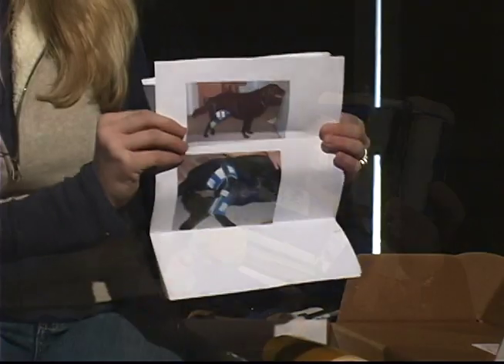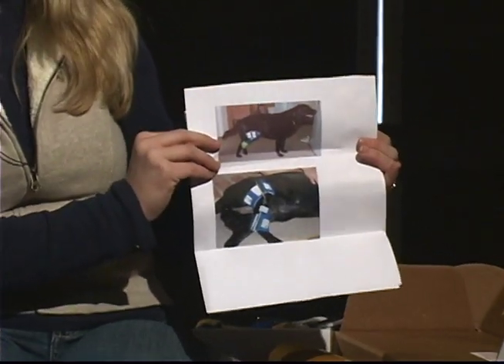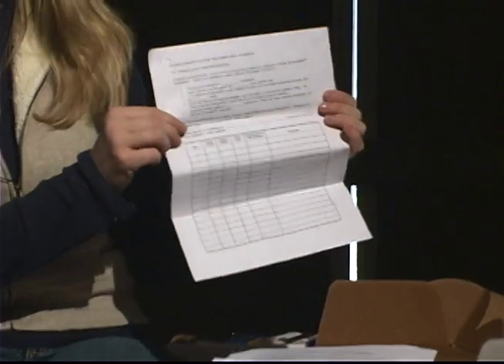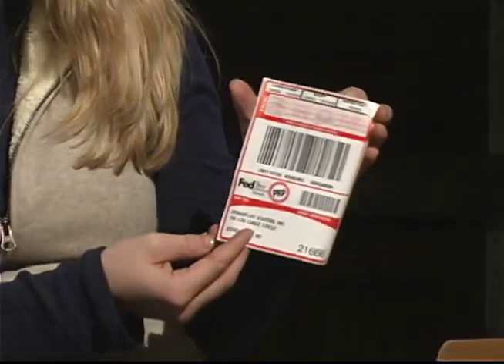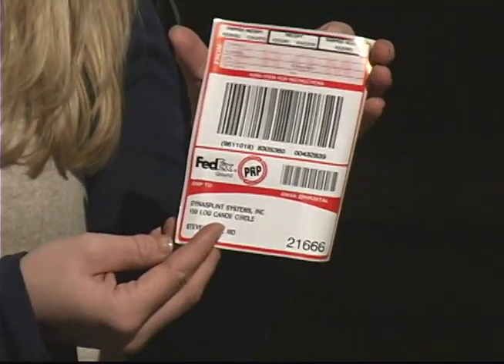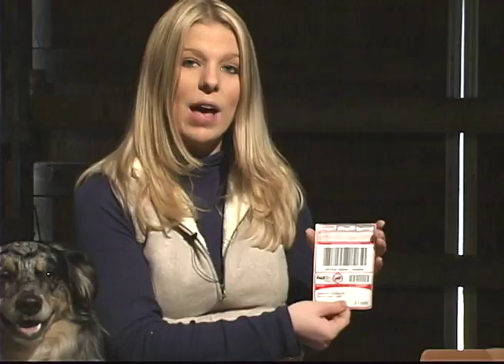Thank you for choosing Dynasplint Systems, where we hope to stretch beyond your expectations. Your Dynasplint will arrive fully padded, labeled, and ready to apply to the animal. In the box, you will also find photographs, written fitting instructions, as well as a treatment schedule that your Dynasplint consultant has developed specifically for your dog. You will find additional padding, an adjustment tool, as well as the FedEx prepaid label. Please save this FedEx prepaid label, as well as the box, as you will need them when your animal's treatment is complete.